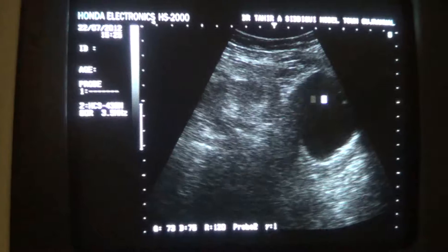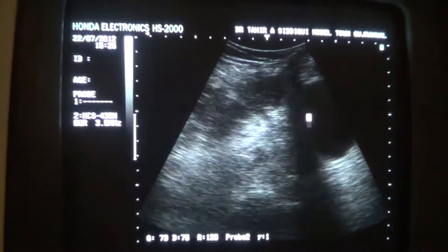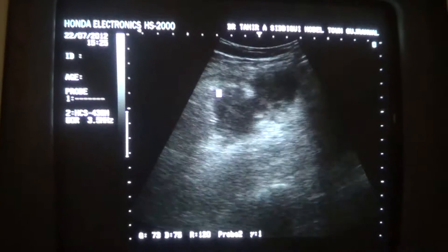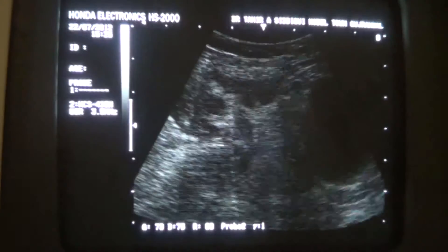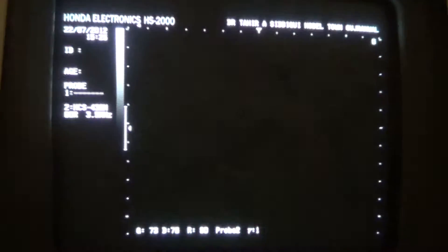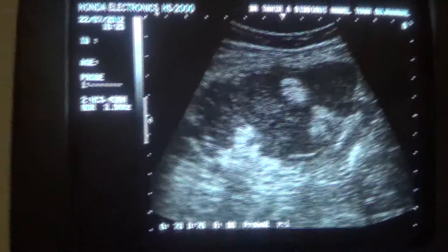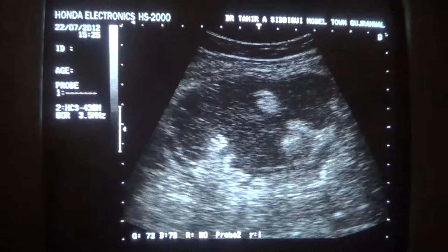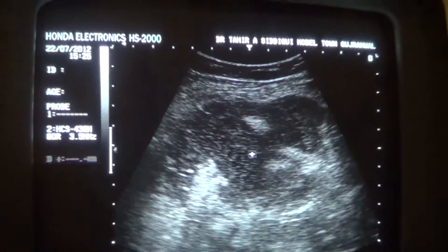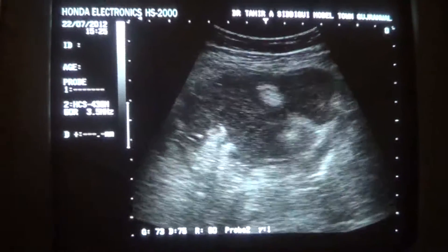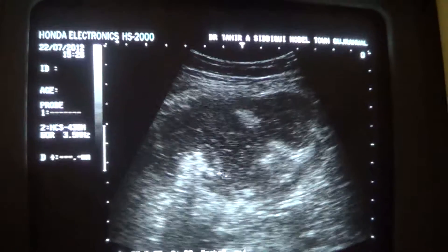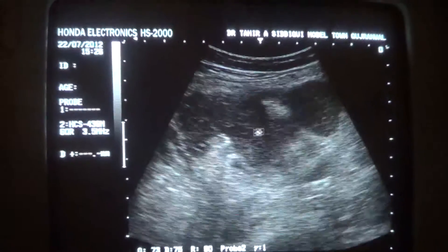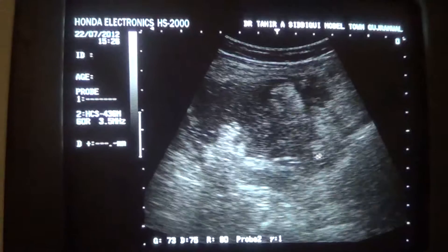I get the longitudinal view of the urinary bladder. At the same time, I see this area along the right lateral margin of the urinary bladder. This area is full of internal echoes — sand-like particles that you are seeing within it. And within it, you are seeing these echogenic areas without any shadowing.